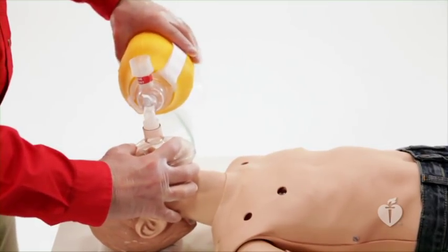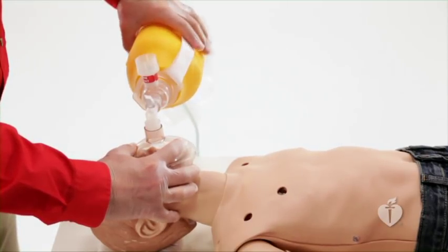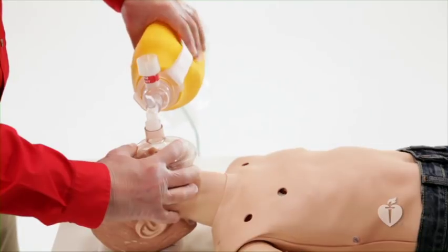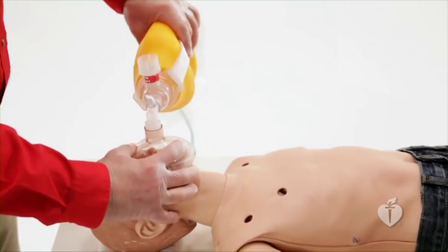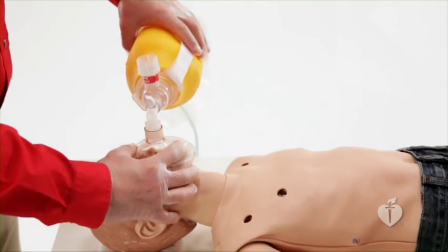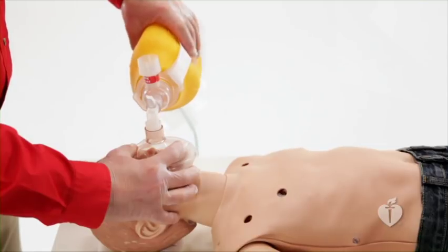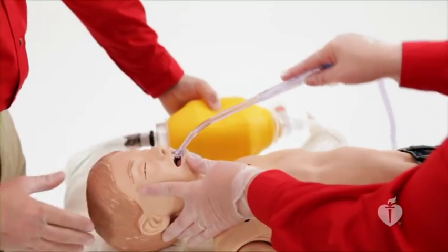Adequate pre-oxygenation should be provided. Pre-oxygenation is the administration of 100% oxygen by mask for at least 3 minutes with normal tidal volume breaths. During pre-oxygenation, oxygen replaces nitrogen in the lung and lengthens the time before desaturation occurs during intubation. Suction the oral pharynx if necessary.